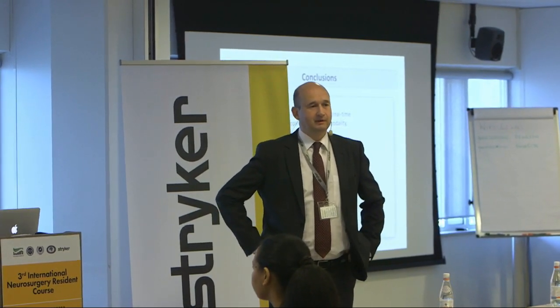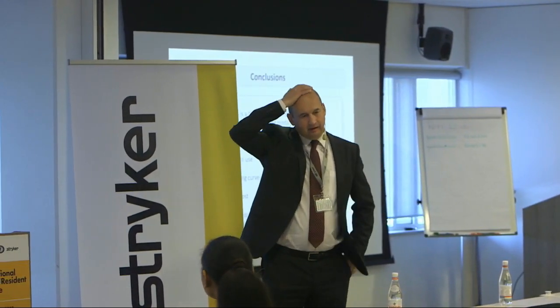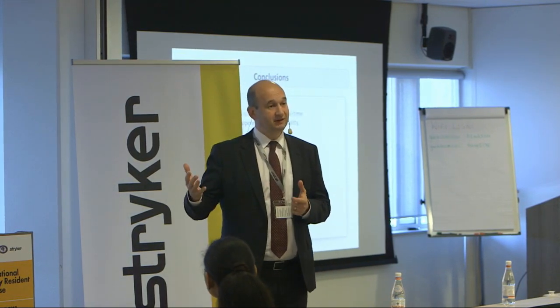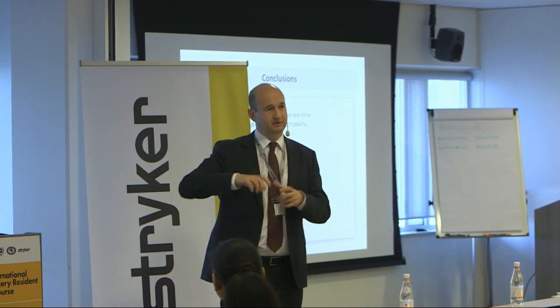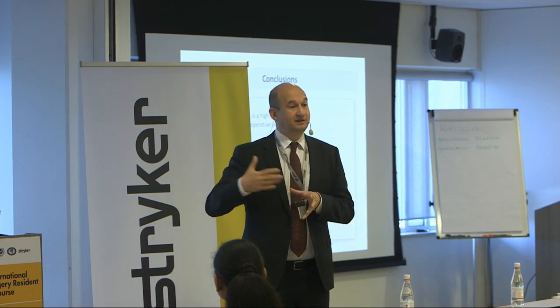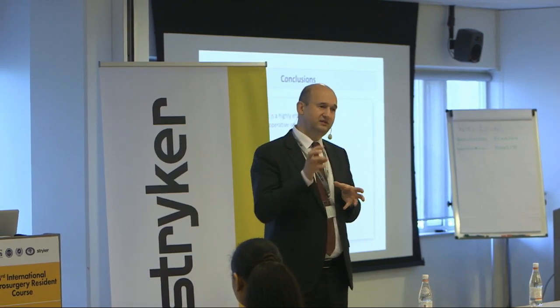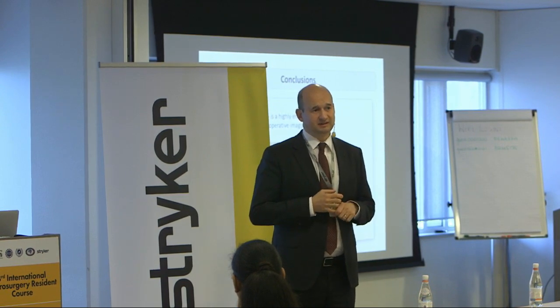Yeah, so that's a good question. I would like to see it integrated into standard neuronavigation systems on a routine basis, and that is still quite a tedious job because you have to reference the probe and you have to have a phantom with which you can reference the probes. I'd like to see that workflow get a lot easier. So you've got your standard navigation system, but the ultrasound is seamlessly integrated into it. I think that's definitely a step that needs to be taken.